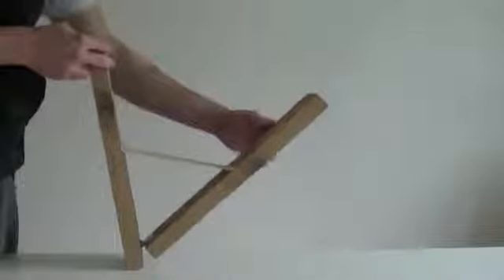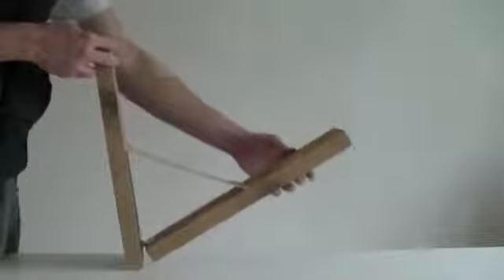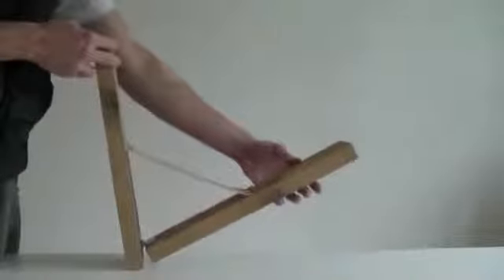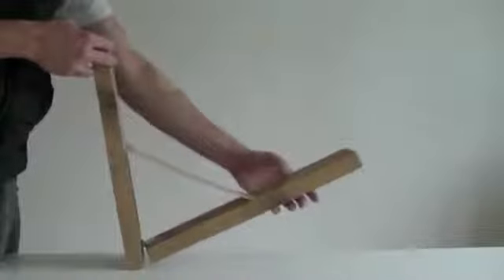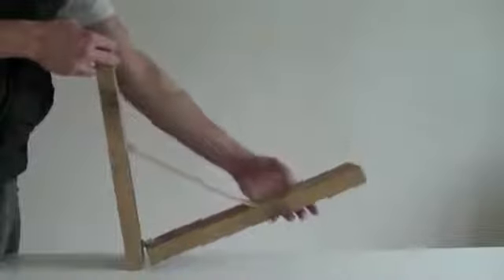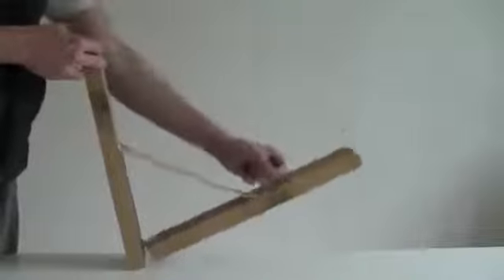When we stretch it, we still get an effect. We still get quite a bit of springiness coming back in, but the effect is slower and less magnitude than what we're seeing when we had the tape connected to the end.